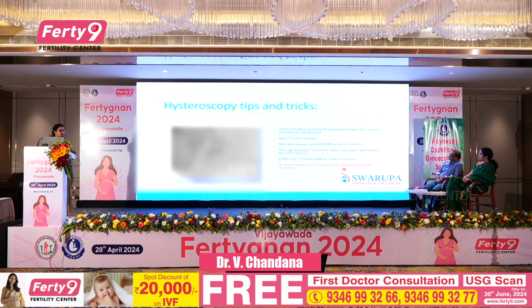And remember to do the hysteroscopy in the proliferative phase, because always remember that the isthmus doesn't give way when you do it in the secretory phase. And the mucosa is better to see in a proliferative phase. The morphological changes are very minimal in the proliferative phase.